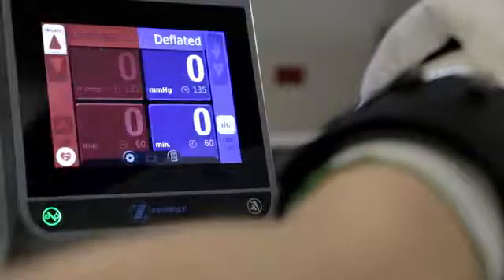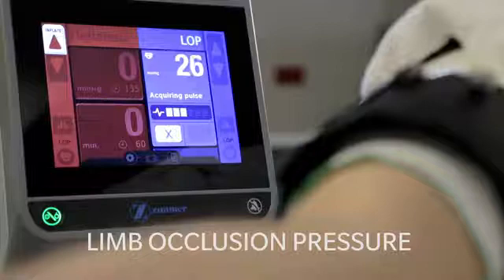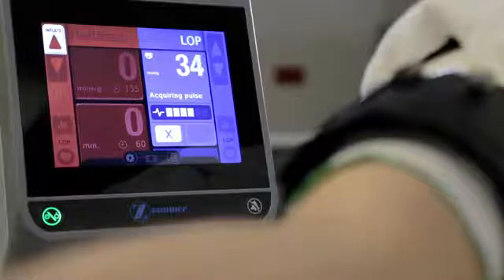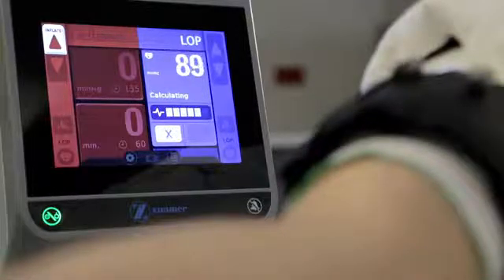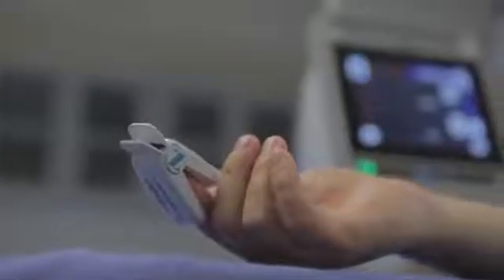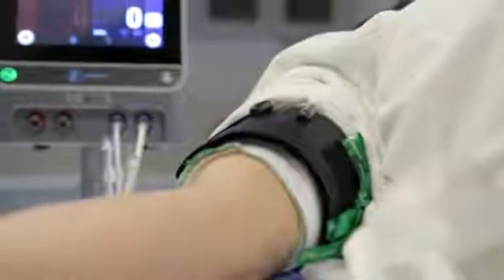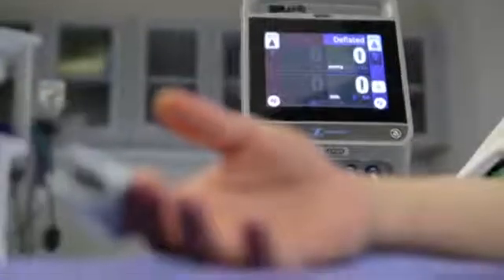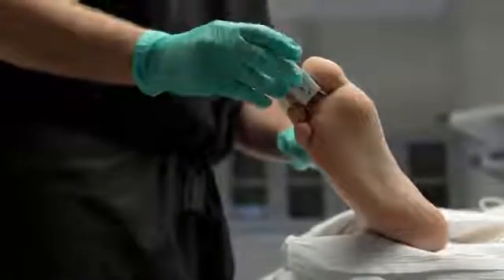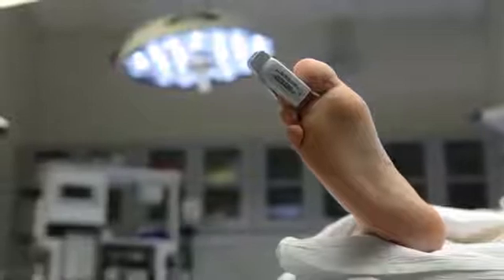The final pre-inflation procedure is calculating the limb occlusion pressure, or LOP. LOP is the lowest cuff pressure at which complete blood occlusion occurs in the operative extremity. Calculating LOP is easy and can be done prior to the patient being draped. Ensure that the LOP sensor is plugged into the ATS 4000 and that the tourniquet cuff has been placed on the patient. Attach the sensor to the patient's operative limb. For lower extremity surgery, the pulse sensor is typically applied to the second toe of the operative limb.